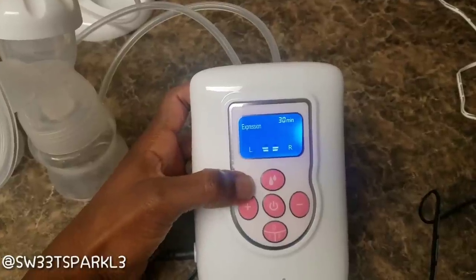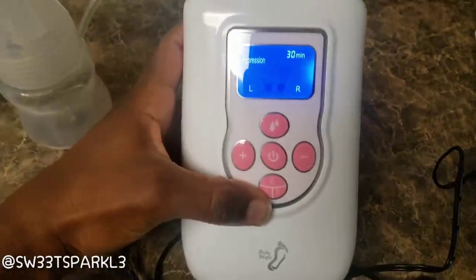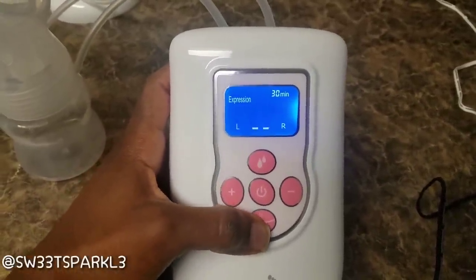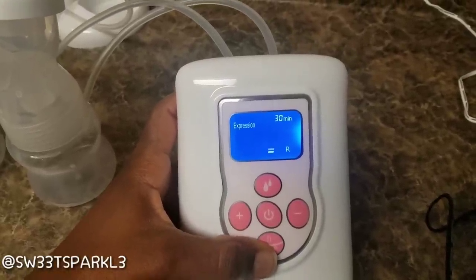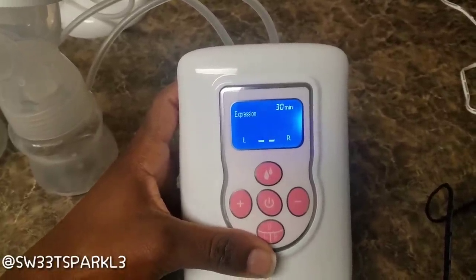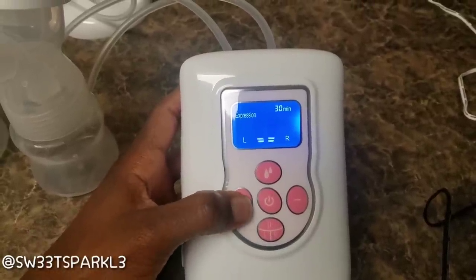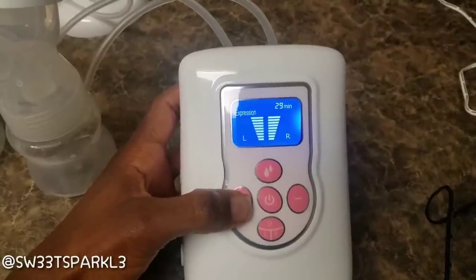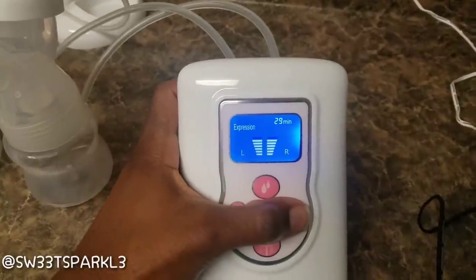There's left and right — this button down here, if you press it you can pump on the left only; press it again and you can pump on the right only; or press it again and you can pump both sides at the same time. This plus button will increase the suction, and the right button will decrease the suction.